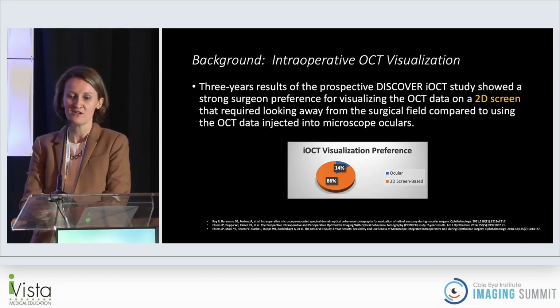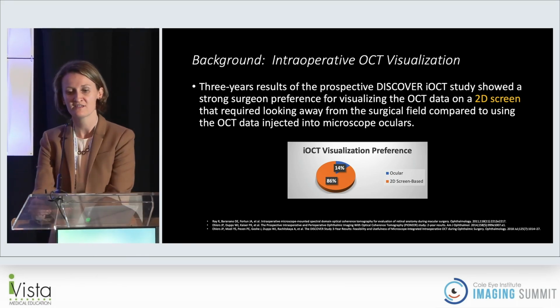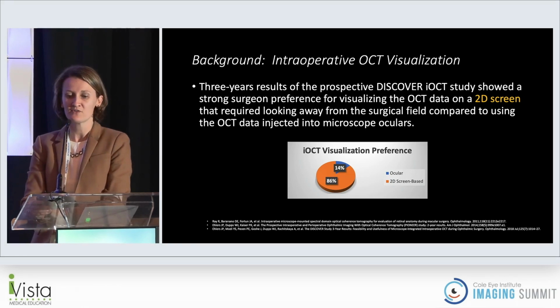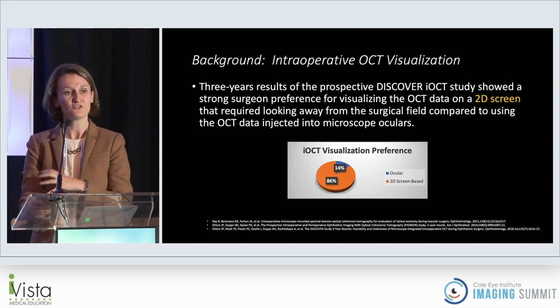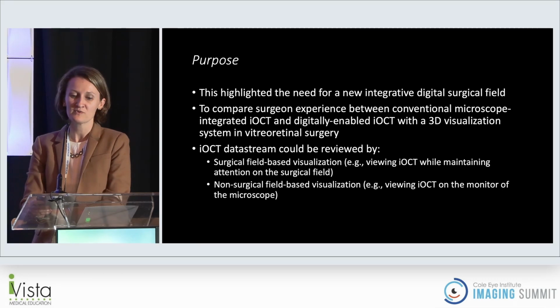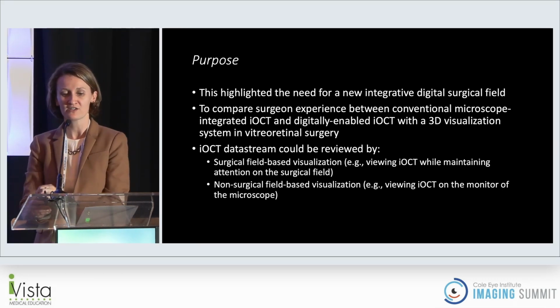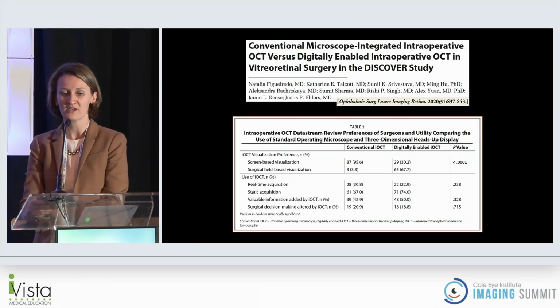So then I just wanted to finish with how we integrate these two technologies together. We've looked at, through Justice's lab, how we utilize intraoperative OCT, finding that initially most people would visualize this on a 2D system, which would force you to look away from the scope. So we looked at whether it is better in these 3D heads-up systems to look at these images on the surgical field or away from it.